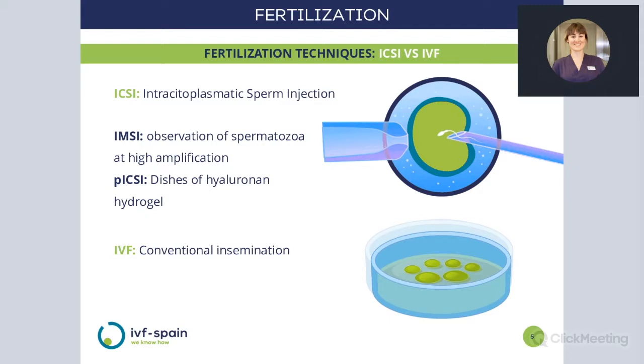So, pros and cons of these two techniques. We all like IVF because it's more natural. So intuitively, it seems less invasive, let's say. The problem is, IVF has more risks because you're not really making sure the sperm cell reaches the place that it should reach. So it can happen that the next day you find there's a failure of fertilization. So basically, none of the eggs fertilized.